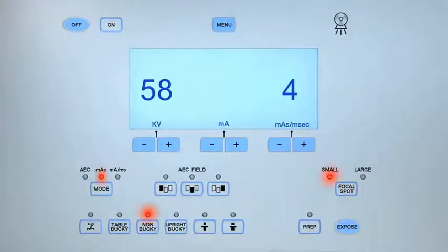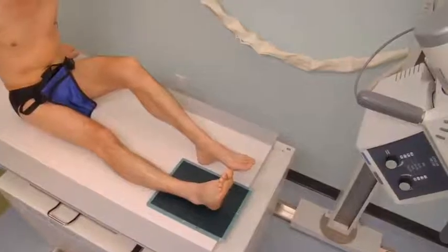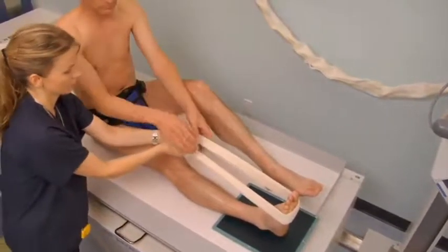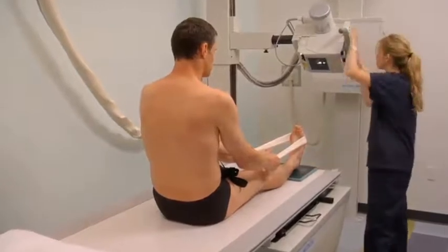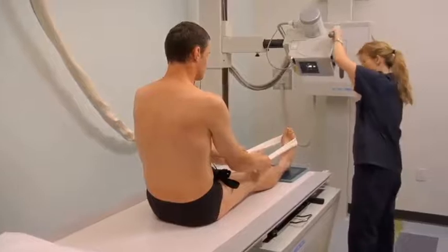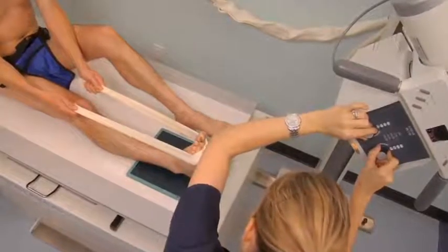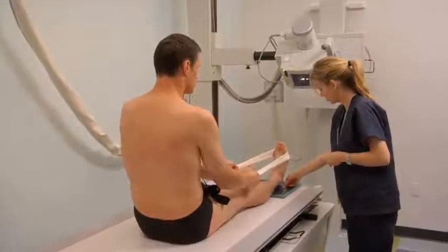For a plantodorsal axial projection of the calcaneus, select the non-bucky and small focal spot setting. Set the exposure parameters to between 60 and 65 kilovolts and 4 to 6 MAS. Ask the patient to sit on the radiographic table and align the mid-ankle with the center of the cassette. Make sure the foot is dorsiflexed and vertical. Place a length of gauze or tape around the mid to distal aspect of the foot and ask the patient to gently pull on the tape to align the plantar aspect of the foot perpendicular to the cassette. Check that the malleoli are equidistant to the cassette. Angle the central ray 40 degrees cephalad and direct the central ray to the base of the third metatarsal. Collimate to include the calcaneus, talocalcaneal joint, base of the fifth metatarsal, and soft tissue structures. Place the appropriate lead marker.